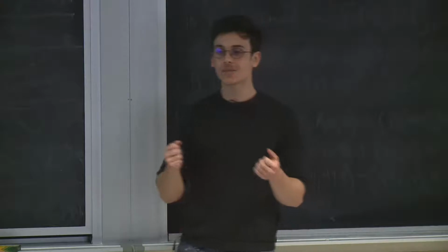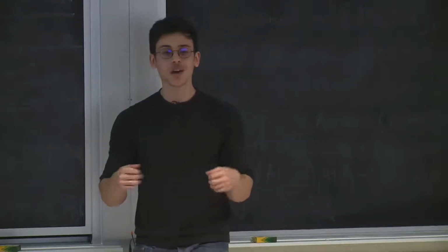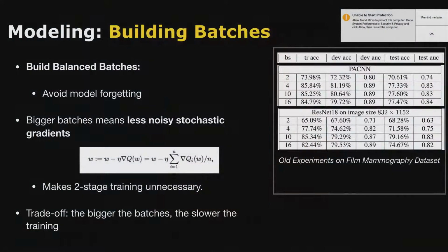As I said before, what are the problems with the signal to noise? One obvious thing to think about is that maybe doing SGD with a batch size of 3 when the lesion is less than 1% of the image is a bad idea. If I just take less noisy gradients by increasing my batch size, which just means use more GPUs, take more steps before doing the weight update, we actually find that the need to do this actually goes away completely.